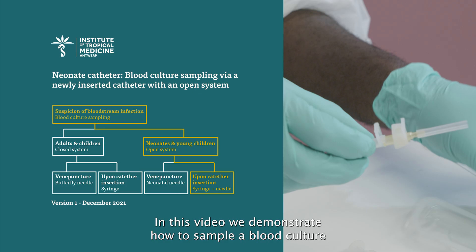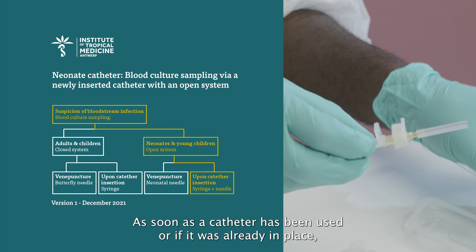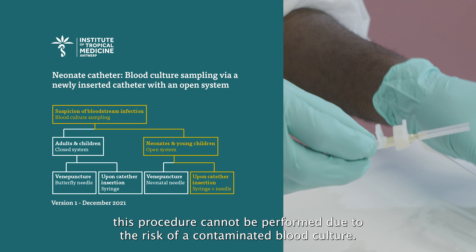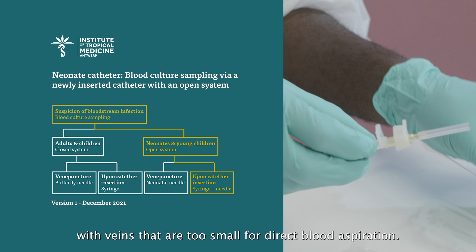In this video we demonstrate how to sample a blood culture via an open system from a newly inserted peripheral catheter to avoid an additional venipuncture. As soon as a catheter has been used or if it was already in place, this procedure cannot be performed due to the risk of a contaminated blood culture. By using an open system, no vacuum is applied to the veins, so this technique is reserved for young children and neonates with veins that are too small for direct blood aspiration.